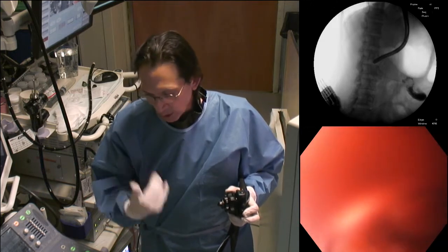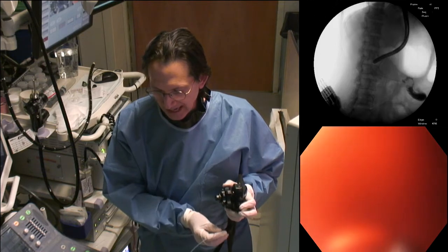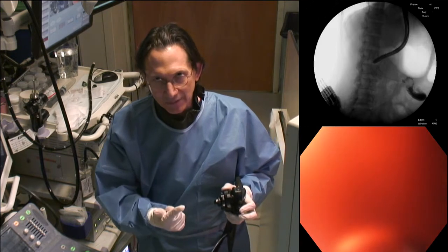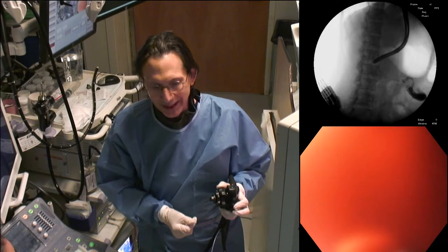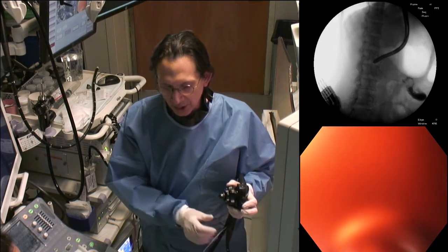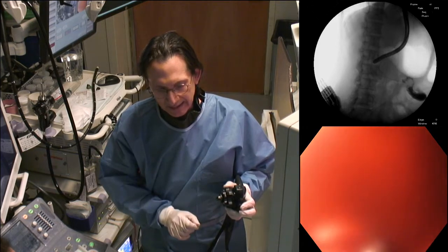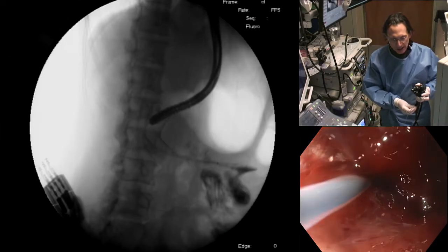And perhaps in hindsight, we could have started directly with the nasocystic catheter rather than with a conventional ERCP catheter. But the drawback of using a nasocystic catheter is that it's got the pigtail at the end that's going to deploy, so you're not going to have the same maneuverability. So I think this was a sound choice, starting with the ERCP catheter, confirming that we are downstream from the tumor stricture, and now switching out for the nasocystic catheter. We will do an exchange now.